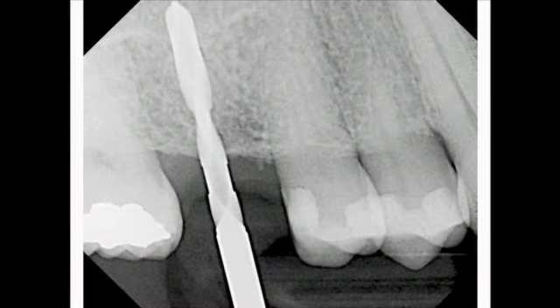Here's a radiograph illustrating the angulation; the implant will be placed in the center of the ridge. The drill was placed about 9 to 10 millimeters into bone. You can see on the radiograph that the notches on this 2.2 twist drill are clearly delineated, 7 millimeters being the first notch in the bone, then 9, and then 11. So we're not quite at 11, so we're at 9 or 10 millimeters into bone.